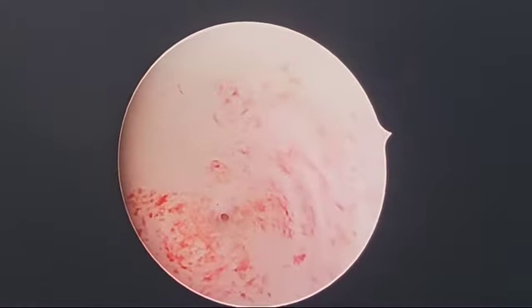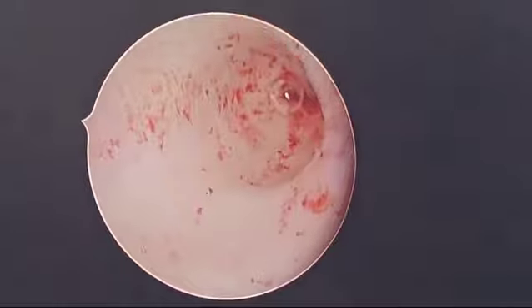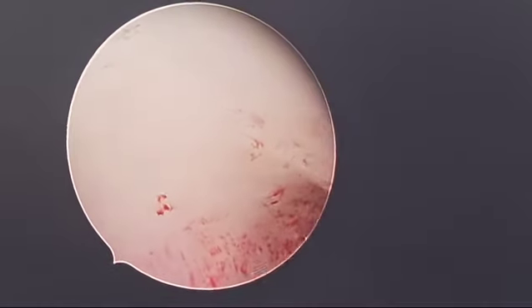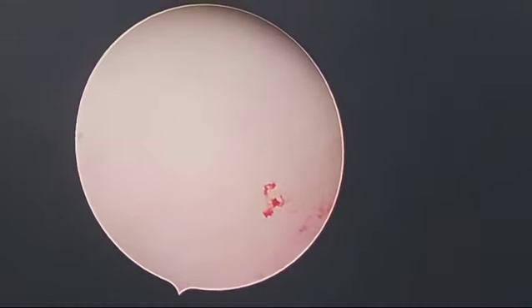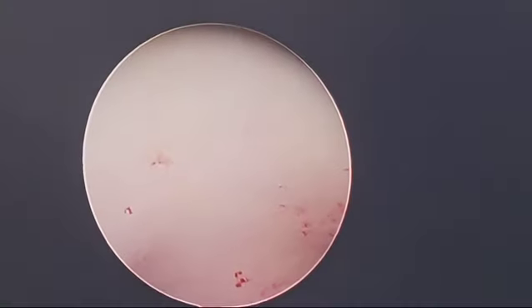This is the right ostia, and this is the left ostia. We will definitely be taking an endometrial biopsy for TB-PCR and TB culture.